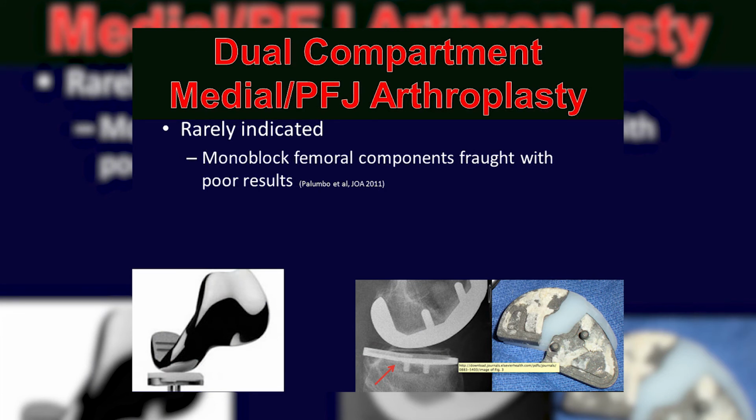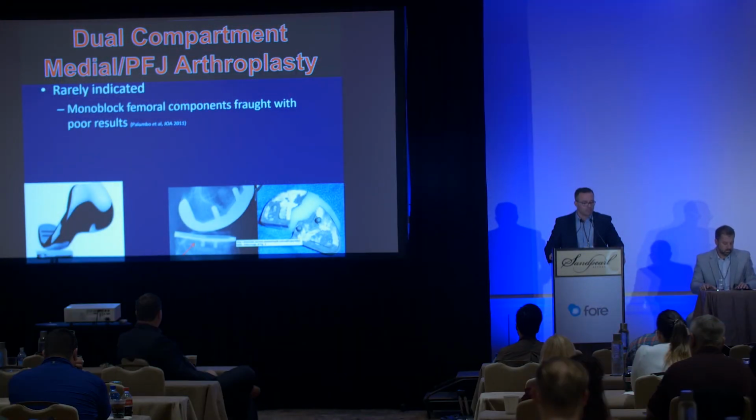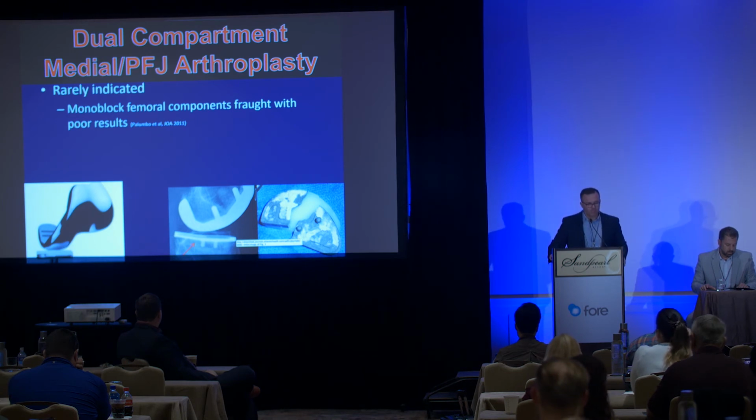Just to briefly discuss this concept of dual compartment medial patellofemoral joint arthroplasty, there are several implants in the market. In my view, these are rarely indicated. I published on one of these implants in 2011. It was fraught with really poor clinical results and even catastrophic failure in several cases. And in my hands, this is just not even a consideration.